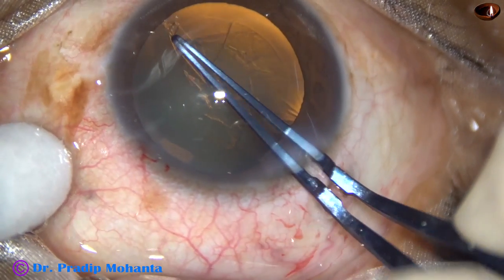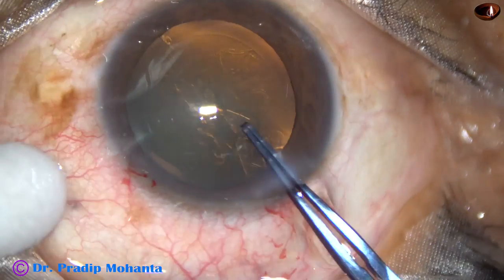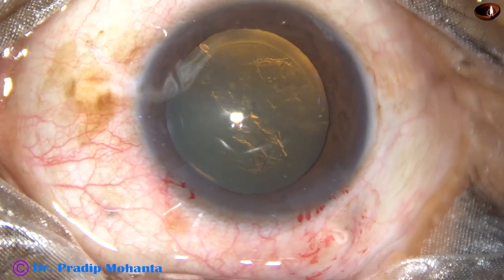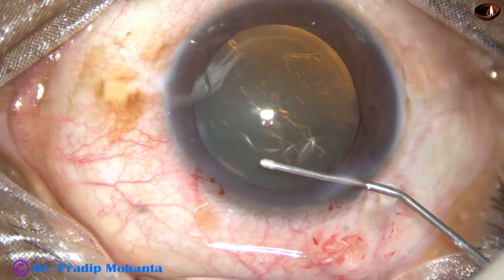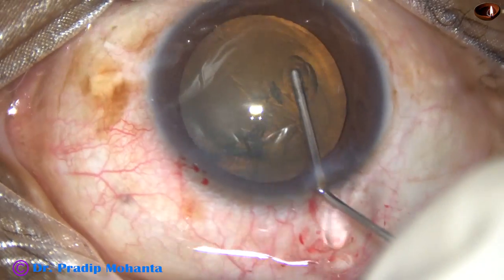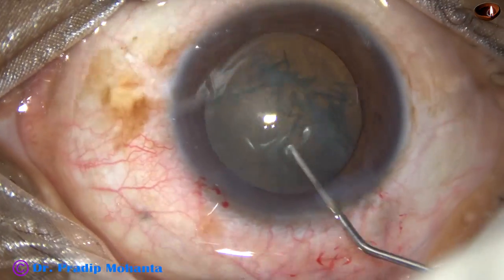Continuous, curvilinear capsulorhexis. And this is a fairly round rhexis of adequate size. Some visco is removed by depressing the posterior lip of the main wound. Hydrodissection is done, and then the nucleus is rotated.